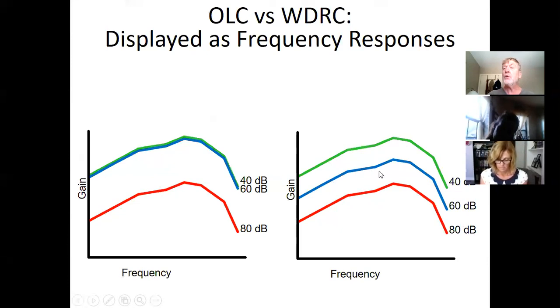Compression is already occurring with WDRC for mid inputs like 60. It's already being applied, and it's steadily being applied, let's say at a ratio of, say, 2 to 1. A low, weak compression ratio is being applied by WDRC as the inputs gradually increase.